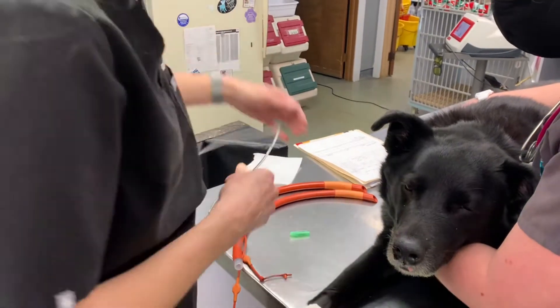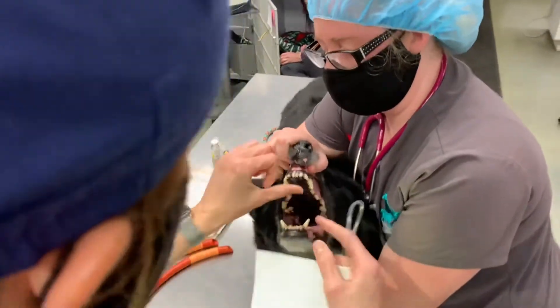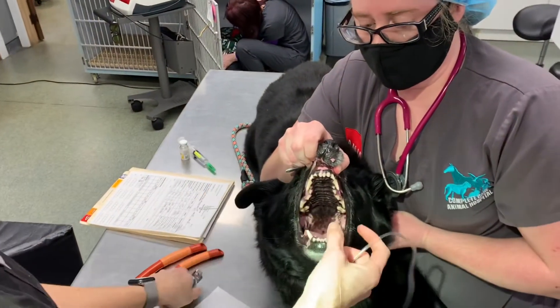We're propofoling this dog down because obviously we've got something different. When you open the mouth, you're going to look for landmarks. This dog has no jaw tone because we're giving it drugs. You can utilize a laryngoscope if you have it.